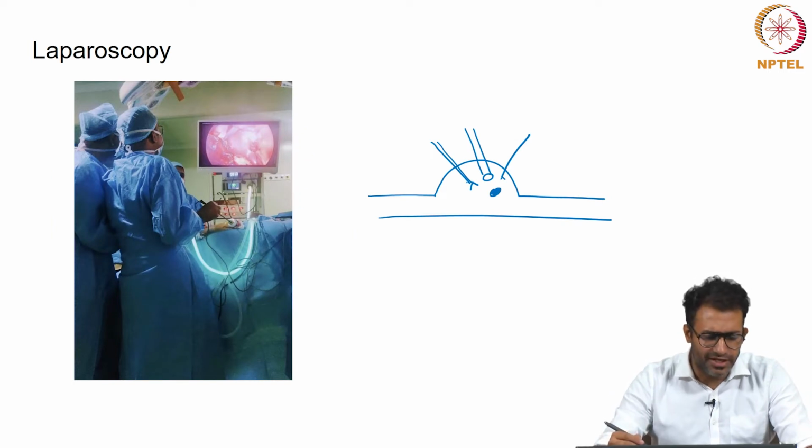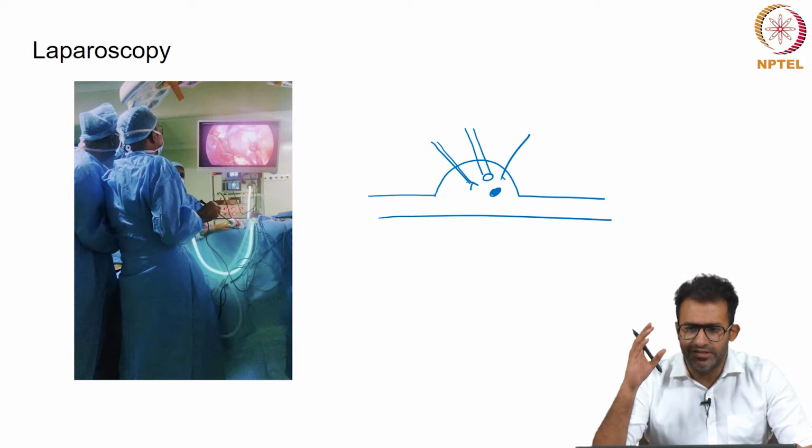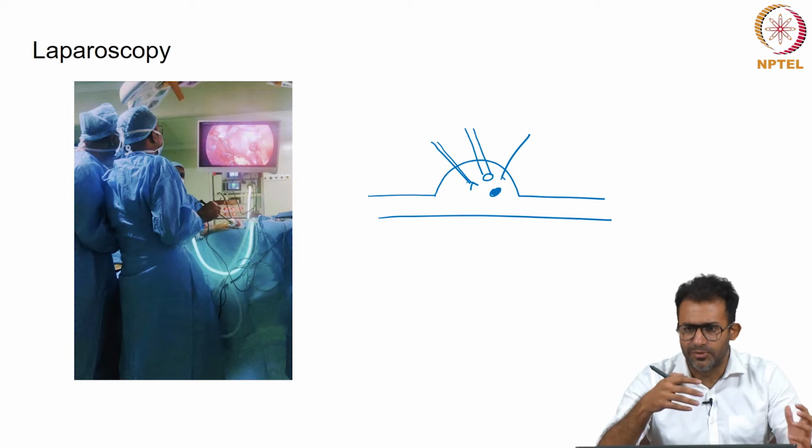Laparoscopy is essentially putting a tube inside the abdomen. That's me on the screen. So, what I am trying to do is remove the gallbladder. The gallbladder is an organ just under the liver, and since the early 90s, laparoscopy has been considered the gold standard for gallbladder surgeries. In many other fields of surgery, laparoscopy is slowly emerging as a gold standard.